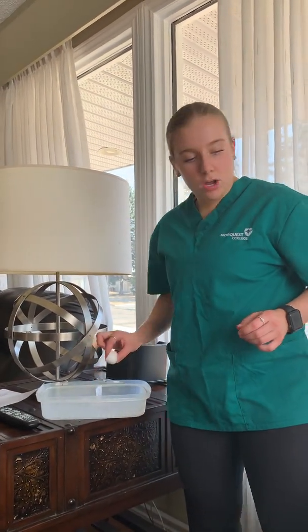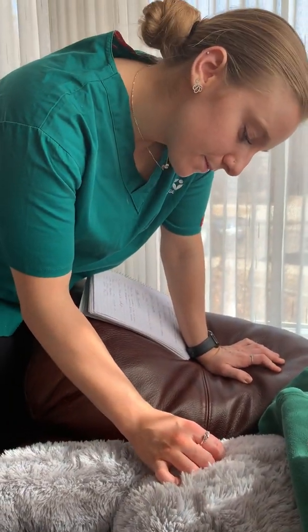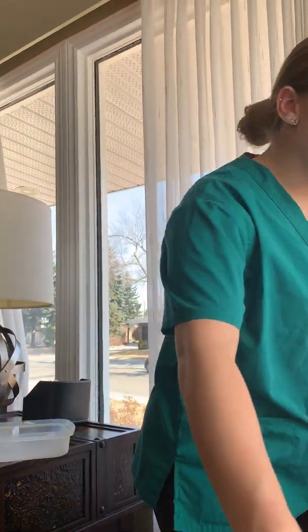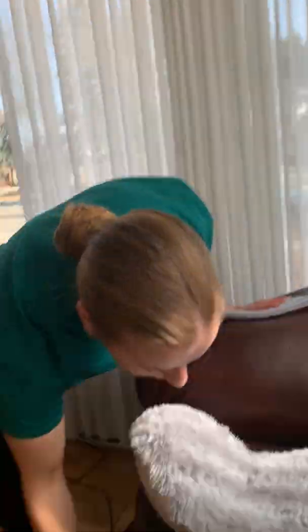I will then place the cotton pad on the injection site and hold pressure there. I will check if there's any bleeding. If so, tape the cotton pad. If not, throw the cotton pad in the garbage. I will make sure that I throw all my sharp objects into the sharps, everything else into the garbage. I will then make my patient comfortable once again, leaving them in a comfortable position.